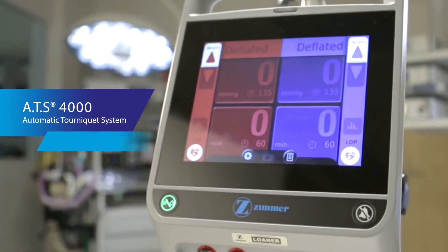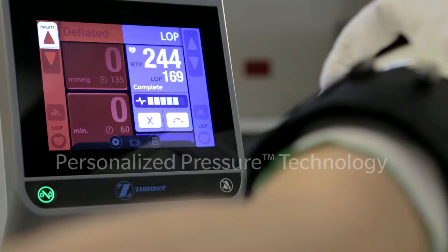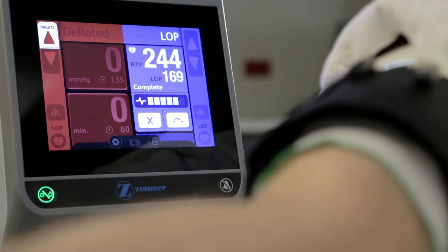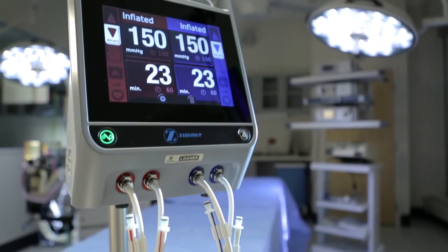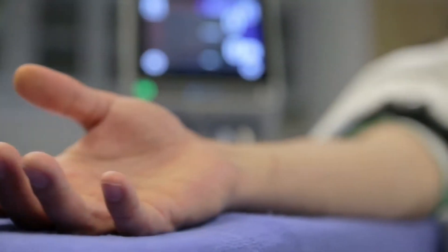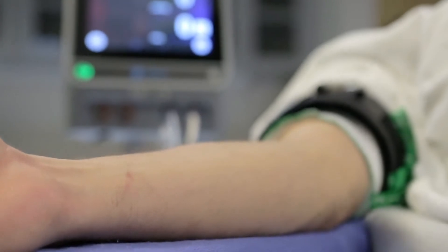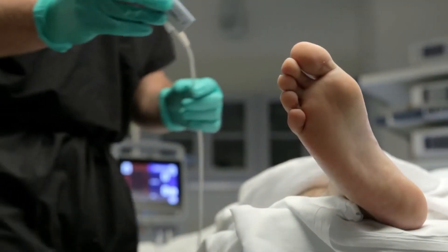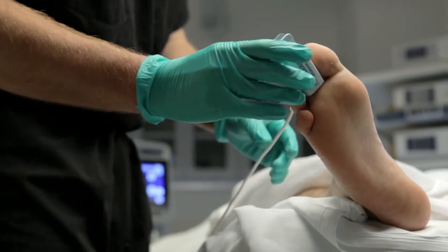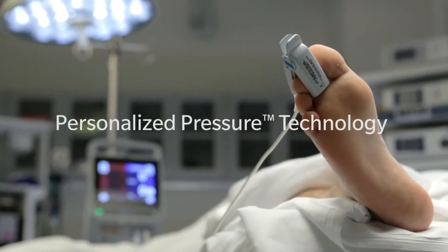Introducing the ATS 4000 tourniquet system featuring personalized pressure technology. At Zimmer Biomet, we believe in treating every patient as an individual. That's why the goal of our tourniquet systems is not to simply stop blood flow. Our philosophy is to use the minimum amount of tourniquet pressure at a specific time, with a specific cuff, to a specific patient's limb. We call this personalized pressure technology.